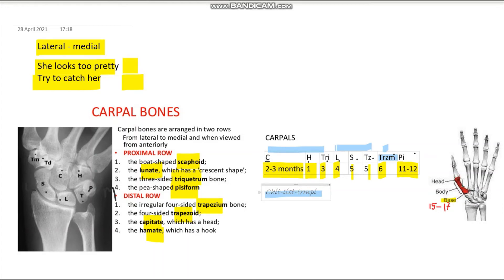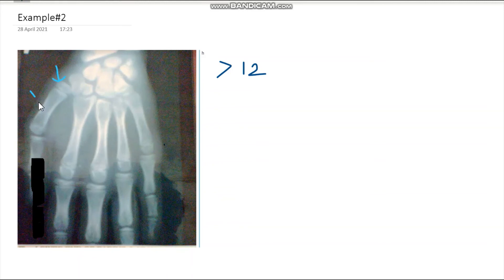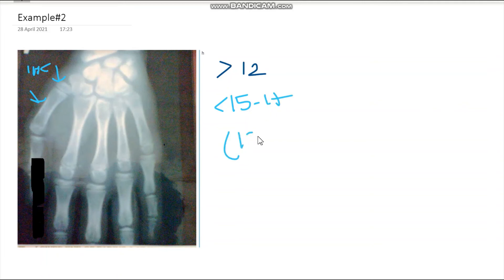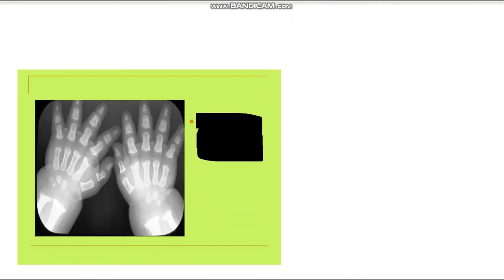One more thing: in this wrist X-ray you can see the base of the first metacarpal. The base fuses with the body at around 15 to 17 years of age. In this example you can see the base and body of the first metacarpal — there is a tiny gap in between, meaning they haven't fused yet, so it is less than 15 to 17 years of age. Combined with the carpal finding, this person is in the range of 12 to 15 years of age.